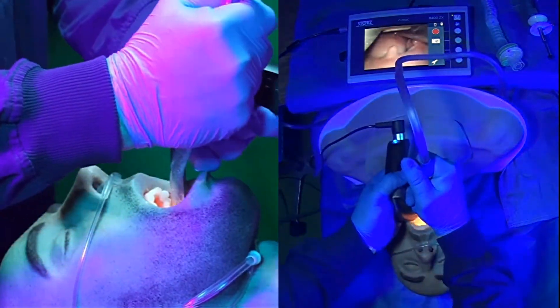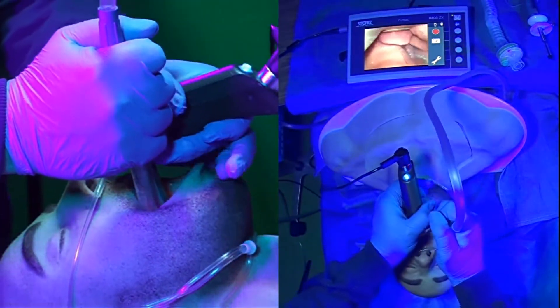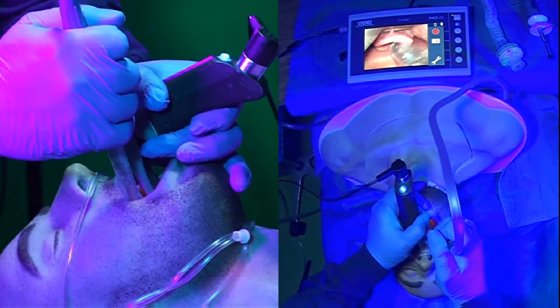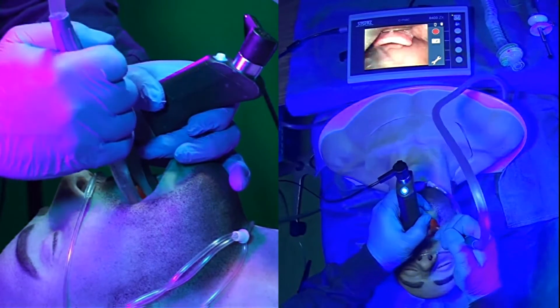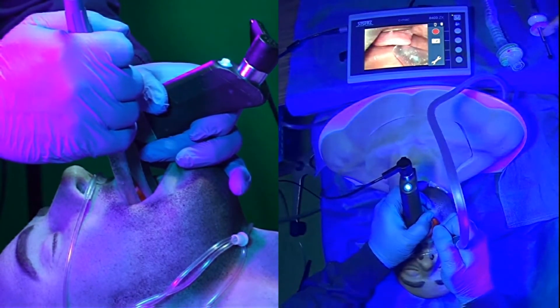Utilizing that pull to the patient's mouth, we can do our laryngoscopy as we work our way down our tongue to the upper glottis. By keeping this catheter from being pinned in the esophagus like we normally do, to keep it in the hypopharyngeal space, we can continue to control some of that vapor release from being discharged up into the intubator's face.